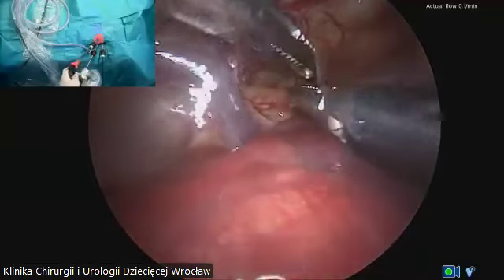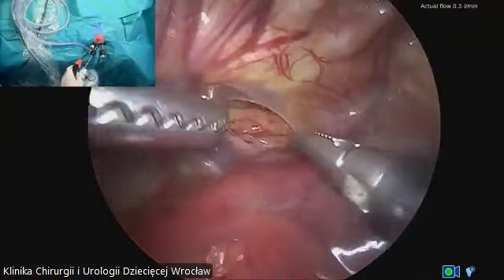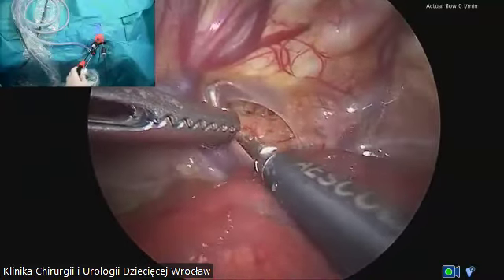I will not go up. Probably the upper pouch is somewhere here. Oh yes, we can see it. But we will not do it today.